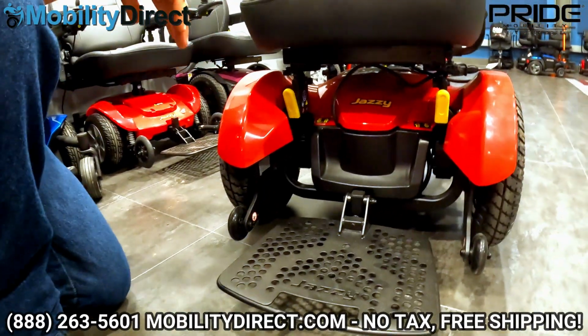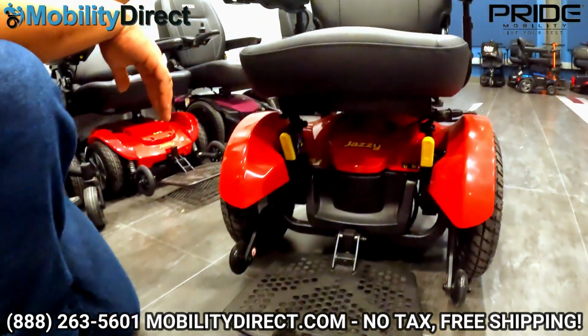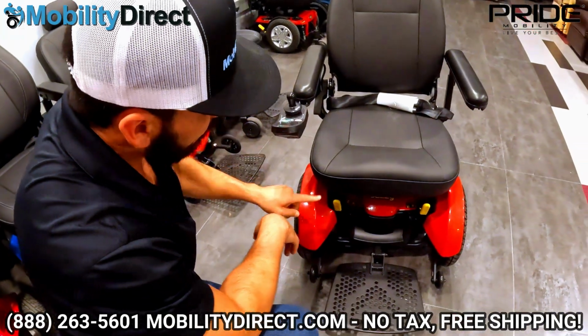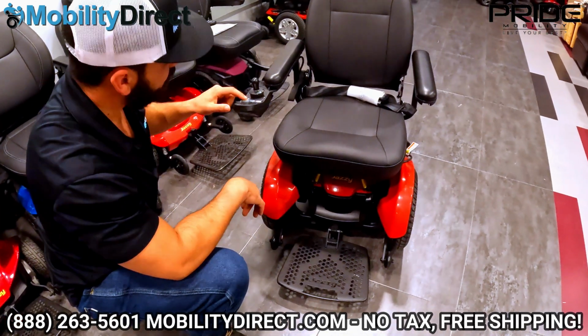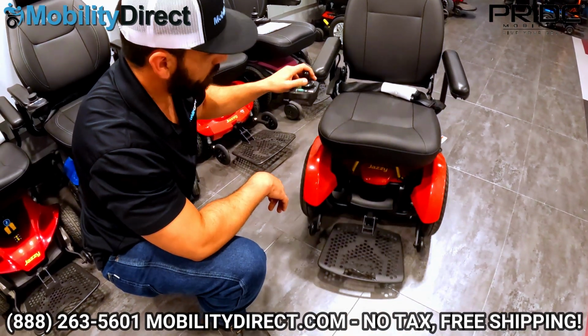Keep in mind, if you turn the unit on right now and you try to use the joystick, it's not going to work. And that's because the brake levers are not engaged, and for safety, they need to be engaged. So you're going to turn the unit off, re-engage the brake levers, turn the unit back on, and it's going to work like it should.